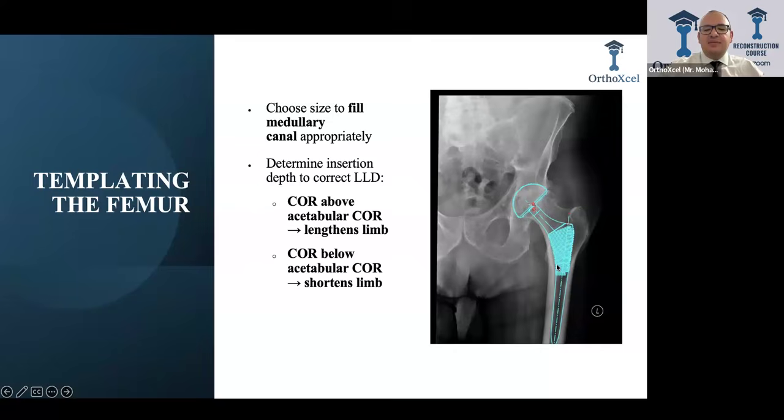If you're using a cemented stem, or an uncemented stem like Accolade, you need to put the stem best fitting into the canal to achieve on-growth or in-growth according to the type of the stem. Even if it's cemented, you need your stem to be centered in the canal and filling as much of the canal as possible. We all know about the French paradox, which, in Charnley's days, he expected that more cement around the stem means more stability.